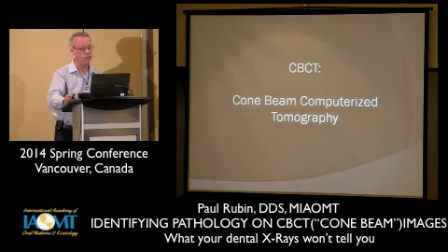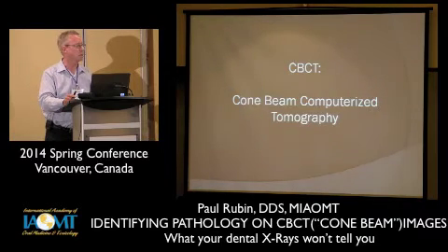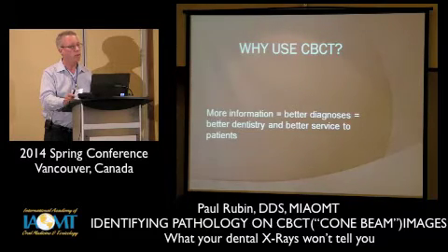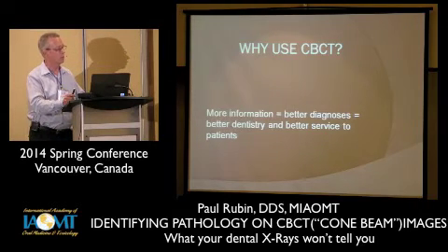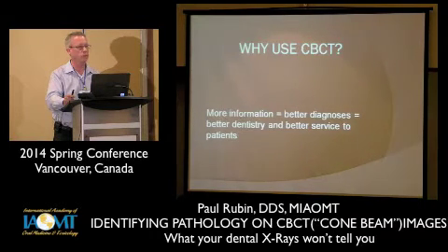CBCT stands for cone beam computerized tomography. Some people just call it cone beam. Some people call it a 3D pano. So why use this? I think the bottom line really comes to this: more information equals better diagnosis, equals better dentistry and better service to our patients. And that's what I think should be the driving force, not that it's going to be a profit center or this or that, but better treatment for our patients.